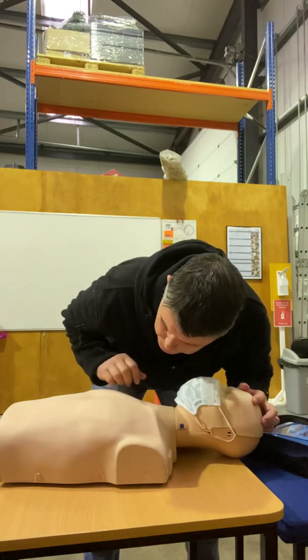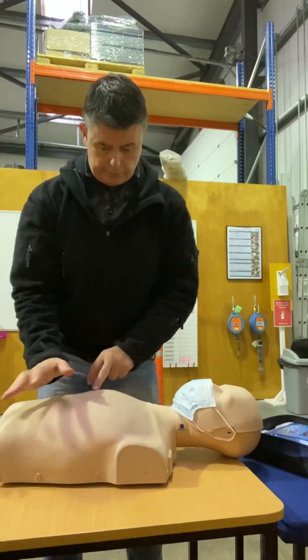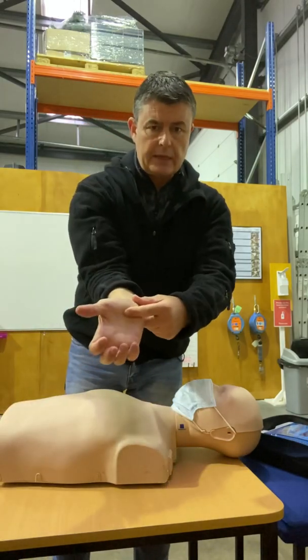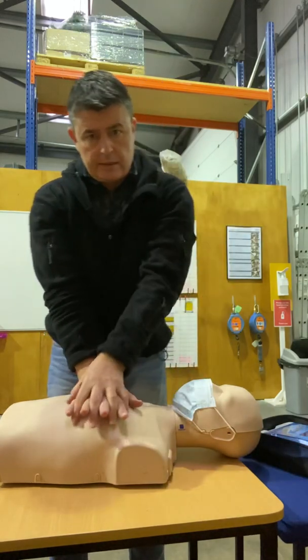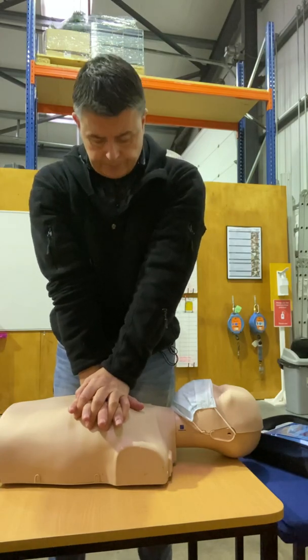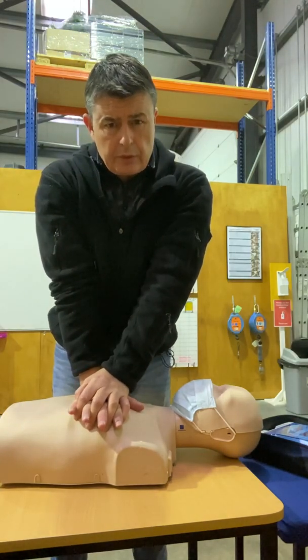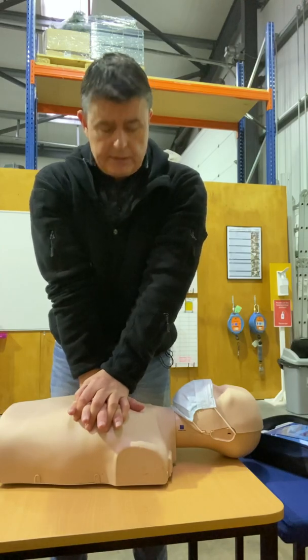If there are no signs of life, expose the bare skin — get in towards the flesh so you can see what you're doing. Heel of the hand and middle finger across the nipple line into the center of the chest, link your fingers, shoulders over the top, elbows locked straight. Then a compression rate of about 100 to 120 per minute and about five to six centimeters in depth.